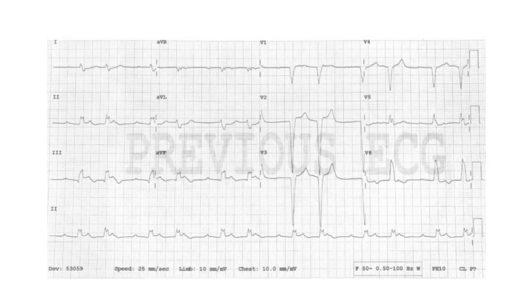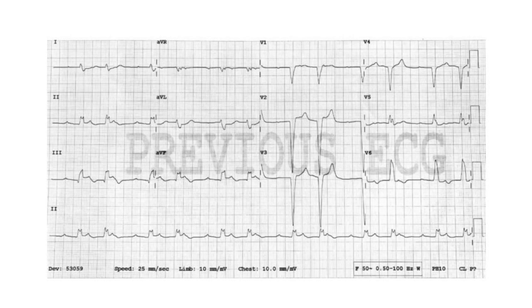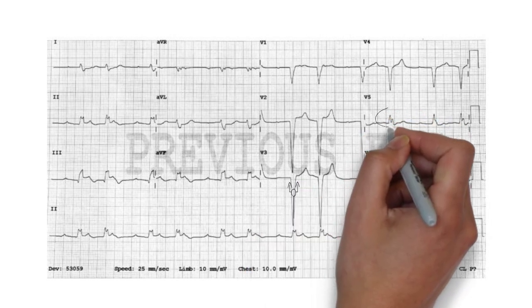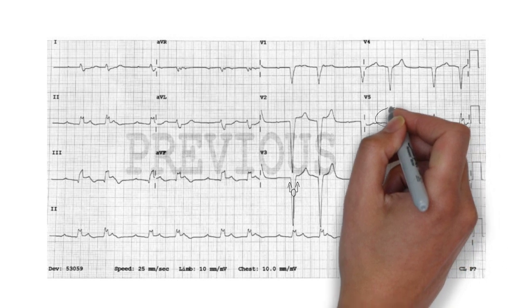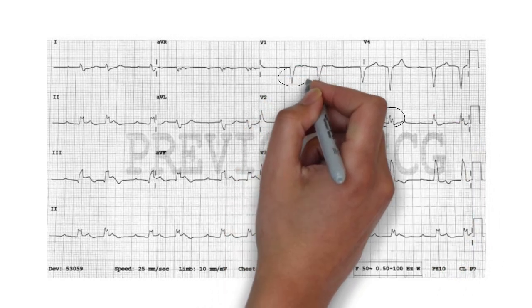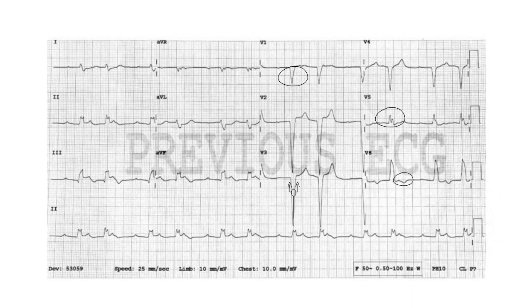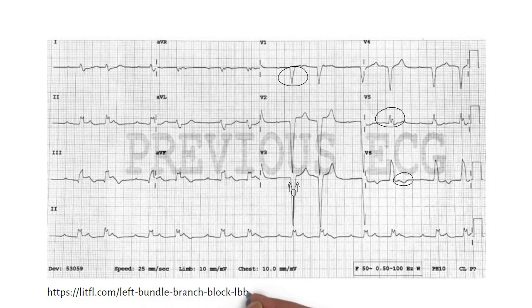Let's try to solve a case together. This is Homer. He is a chronic hypertensive, and this is his baseline ECG. We can see a prolonged QRS duration of greater than 3 small squares, M pattern in leads V5 and V6, dominant S wave in lead V1, and appropriately discordant STT waves. So he is suffering from left bundle branch block, most likely due to his chronic hypertension.